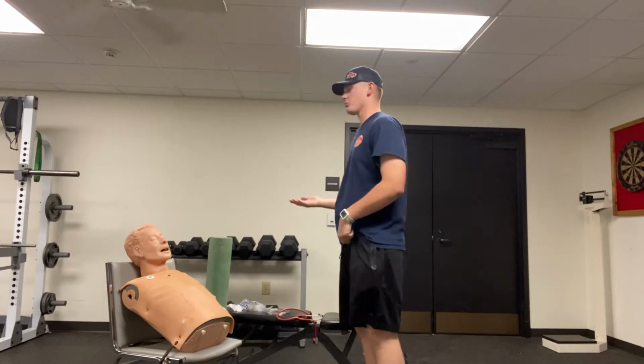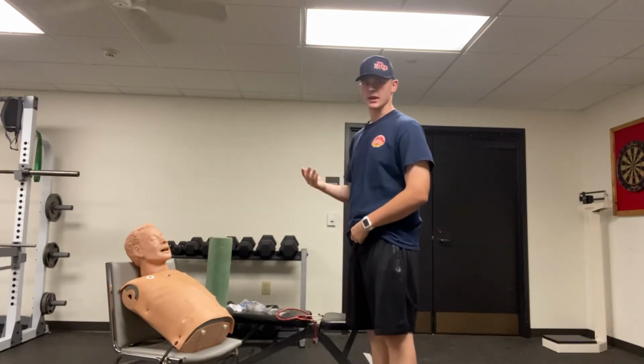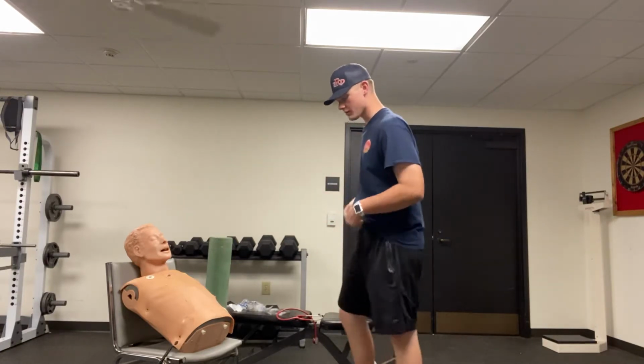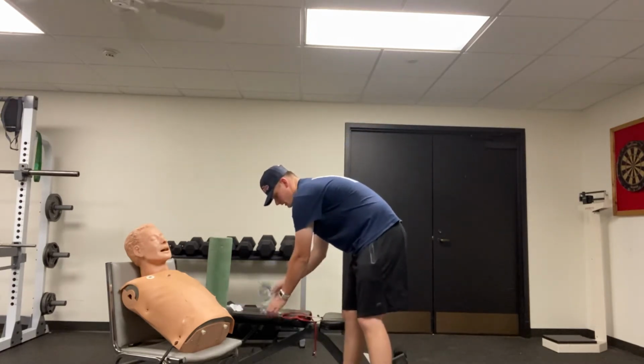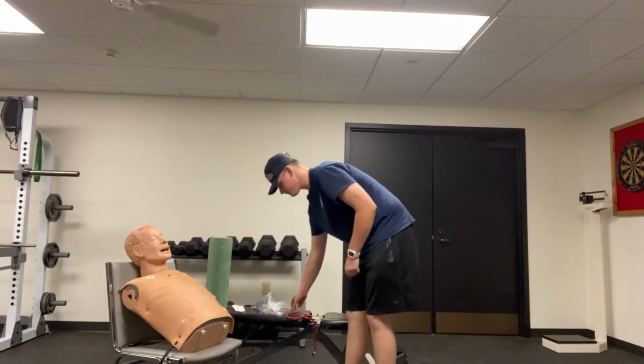I'm going to ask the patient if he has any known allergies, and if he's taking any medications, before I administer this medication. So I'm going to grab my nebulizer. I'm going to have it all hooked up and ready to go. I'm going to have my medication ready as well.